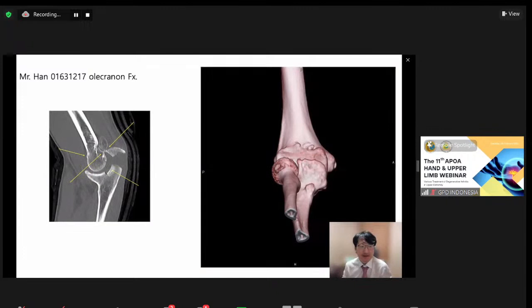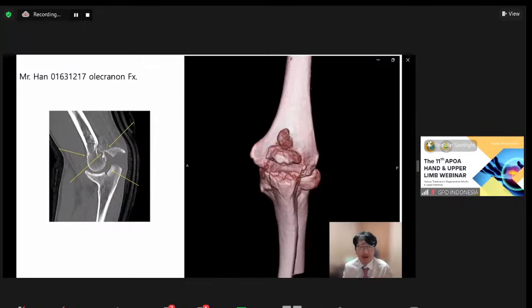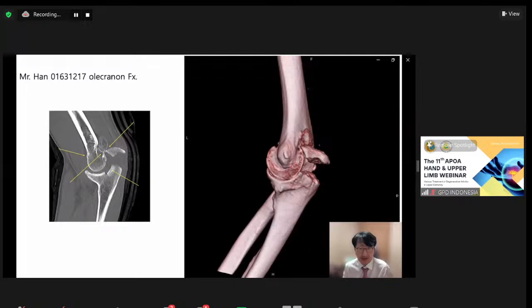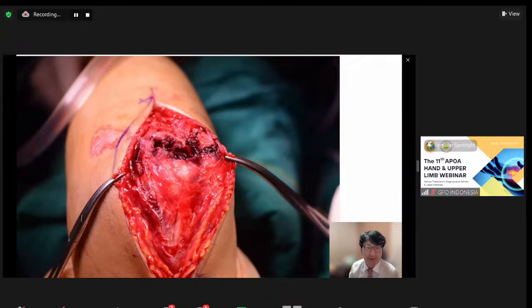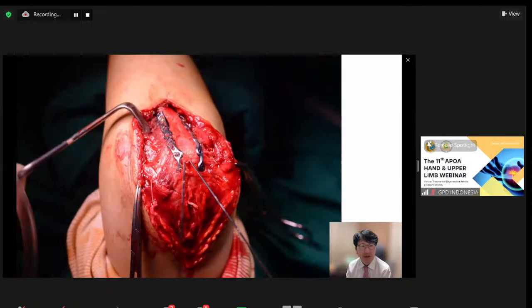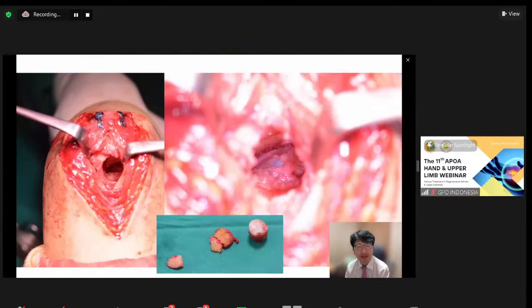This is an interesting case: an acute olecranon comminuted fracture, but there is already a large osteophyte, and somewhat degenerative elbow. I'm afraid that if I just fix the fracture, the existing lesion would be more aggravated. So first, I try to fix the fracture and debride some hematoma and soft tissue. After finishing the plating, I open the distal triceps for the arthroplasty. I make a fenestration using a trephine. Also I check the flexion and extension motion. Then I also do an osteotomy for the coronoid process.